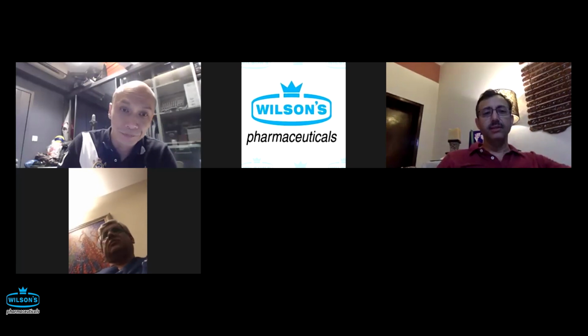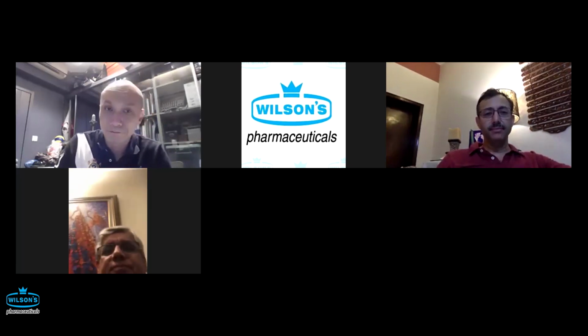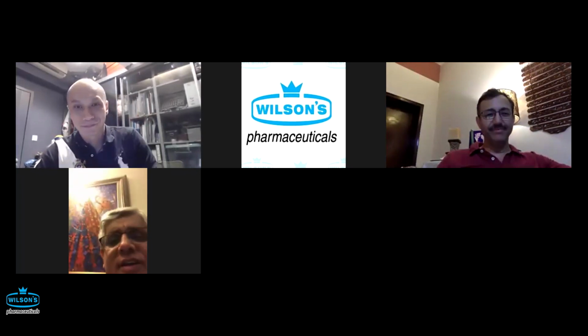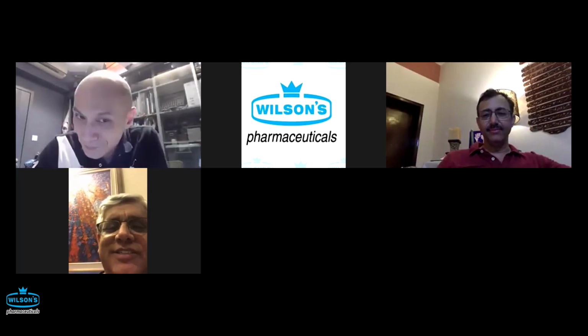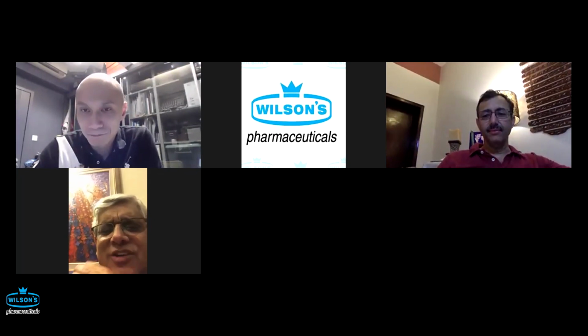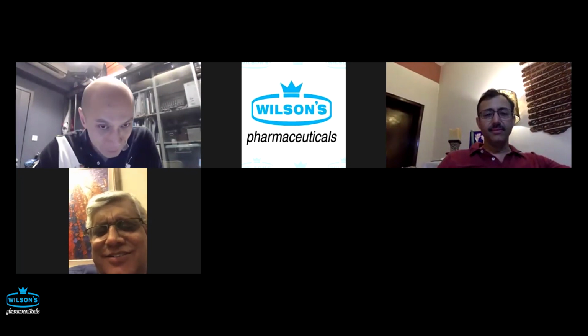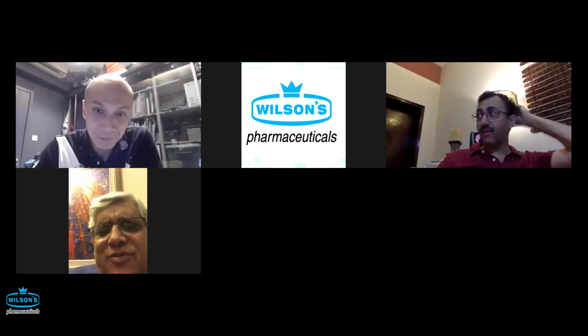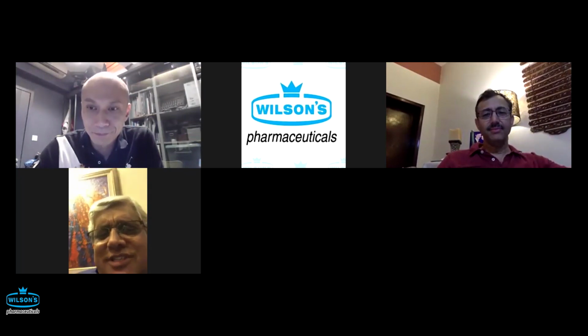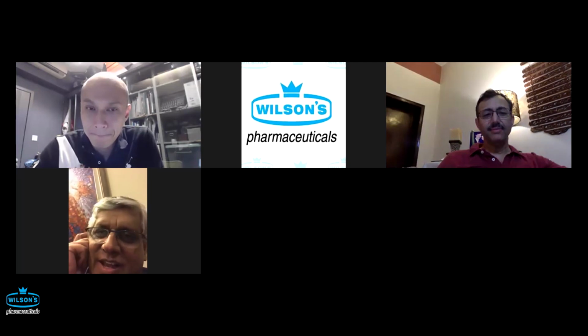Good. Saad, do you want to say something? Excellent, Anthony. Difficult things. Large stones, one thing I would like to add, also depends on one's experience. So something that may appear large to me, Anthony might think it isn't that large, obviously. And also the shape of the stone makes it very difficult, along with the duct size. So there are multiple factors that get into this stone thing. It's nice to see a round stone, even if it's large, and if it's a duct that's nicely dilated.